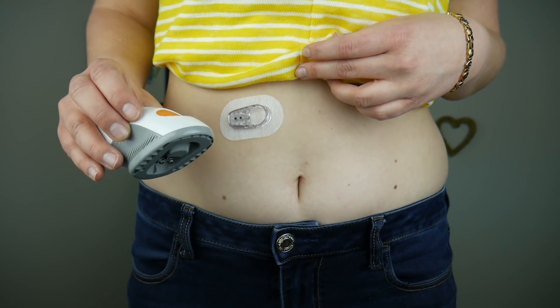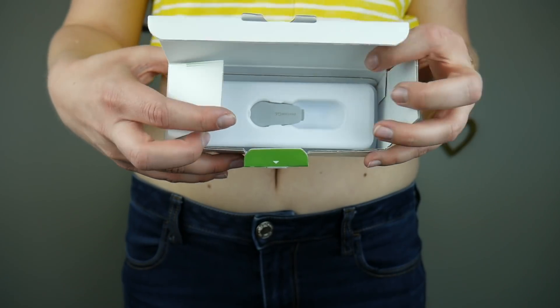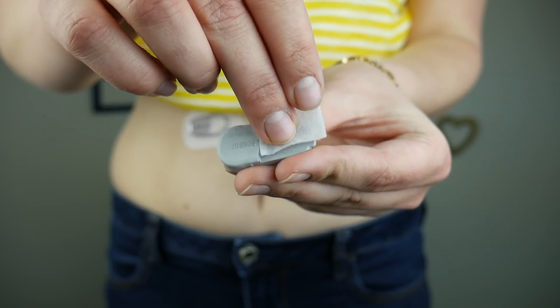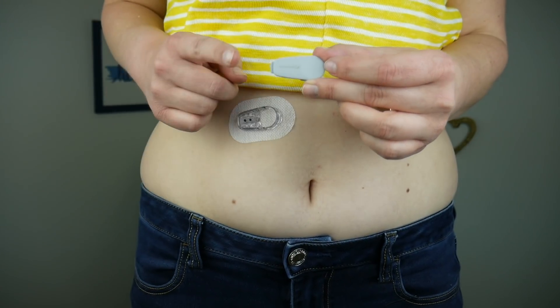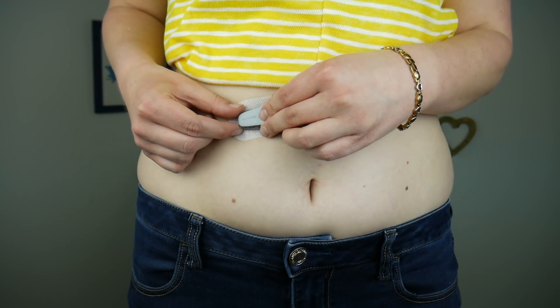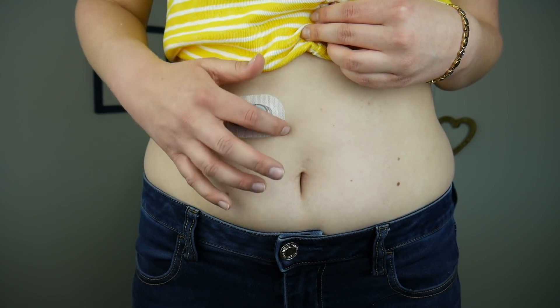I love how easy it is to pull off the inserter once it's in. Now I'm going to take my transmitter out and clean the back with alcohol. Next I'm going to insert the tab of the transmitter into the sensor and snap it into place, then just circle around the adhesive three times.